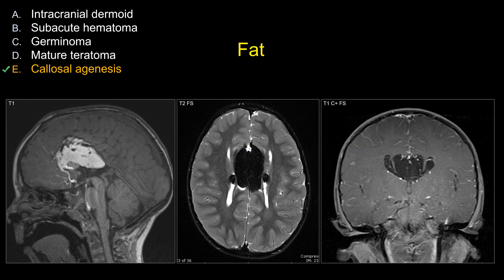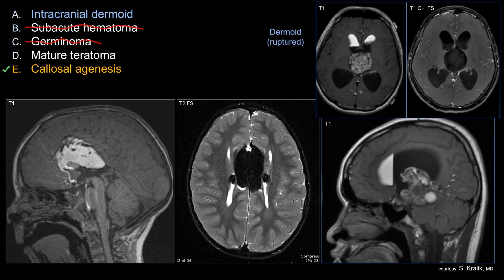That's the correct answer for this case. Looking at other choices that do not work: if you see the presence of fat, you can pretty much eliminate choice B as well as choice C, since neither of those regions should contain fat. As you can see, there is complete fat signal drop after fat saturation on T2 as well as post-contrast T1. Choices A and D do contain some fat element, sometimes quite a bit.